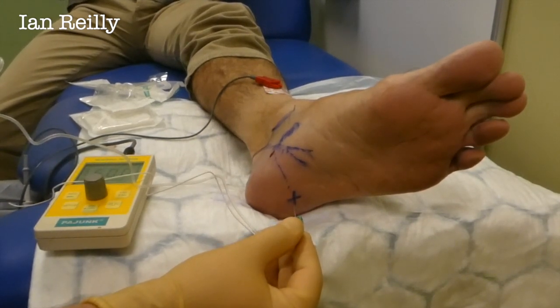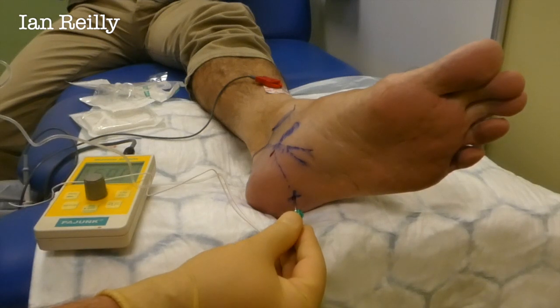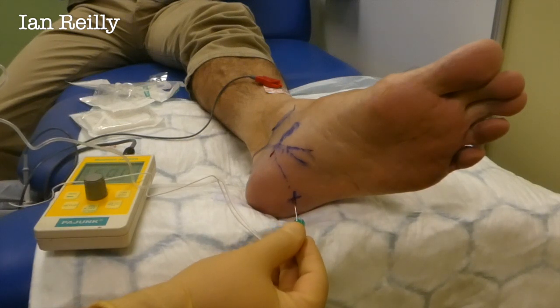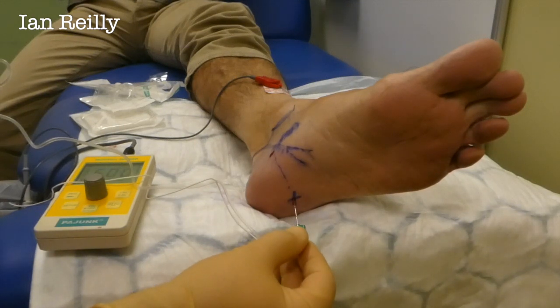George and I were just saying that a lot of practitioners do this sort of thing with ultrasound, which is great if you've got a really high-resolution image — you can sort of see the nerve. But with nerve stimulation, you know you're on it. We're looking to promote this as a technique.